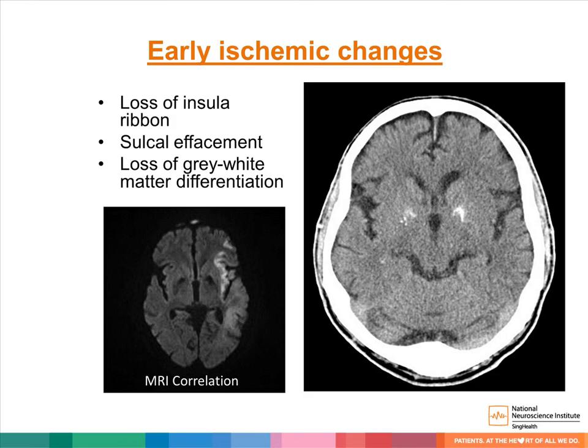Early ischemic changes in the brain parenchyma are demonstrated as swelling, evidenced by sulcal effacement and loss of grey-white matter differentiation. In this example, there is sulcal effacement and loss of grey-white matter differentiation in the left cerebral hemisphere. Of note, there is also loss of the insular ribbon.